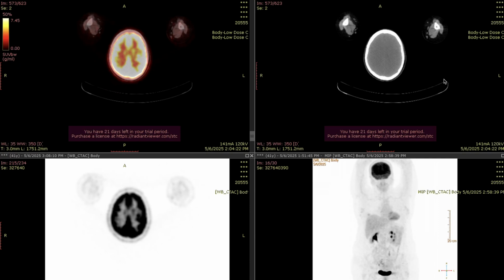because the poorly differentiated lesions in the cancer will be FDG avid and take high FDG activity, and the well differentiated lesions will be radioiodine avid. However, they will be negative on FDG PET CT scan, and this is very important because if these lesions are negative on the FDG, we know that there is no poorly differentiated process in the metastatic lesions, and we can give the patient another radioactive iodine, maybe as empiric therapy, even in some cases with negative iodine.